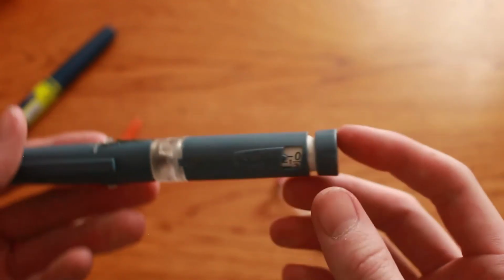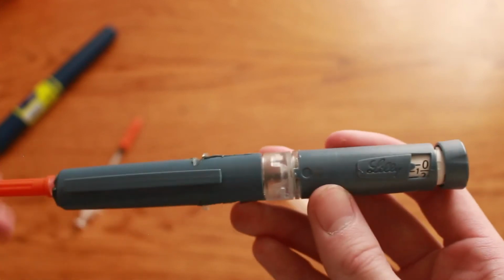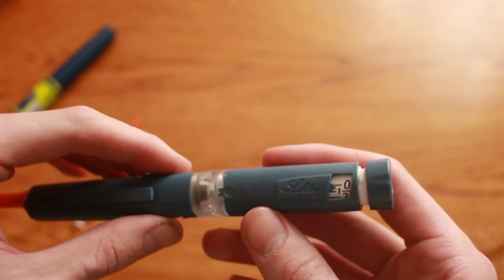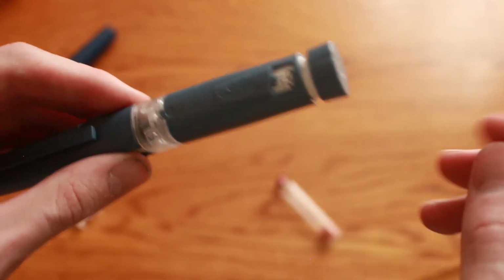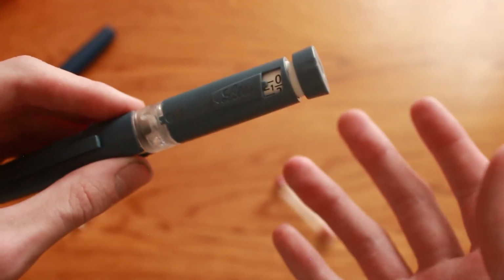So that's all for now, guys. I just want to show you that new incredible invention that I use to reuse my syringes for doing small corrections effectively, safely, and with very precise 1/10 dosing. I think it's really cool, people.